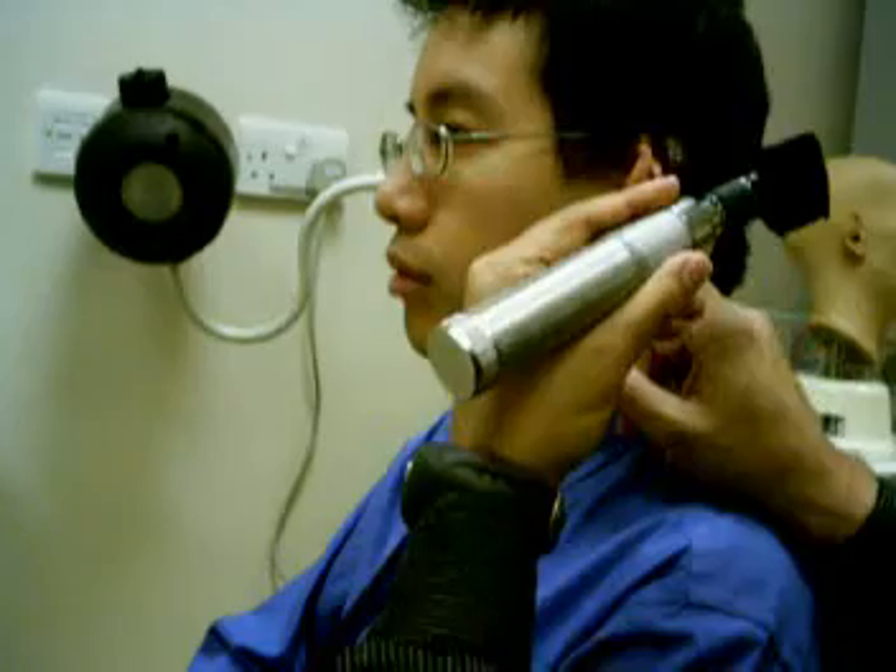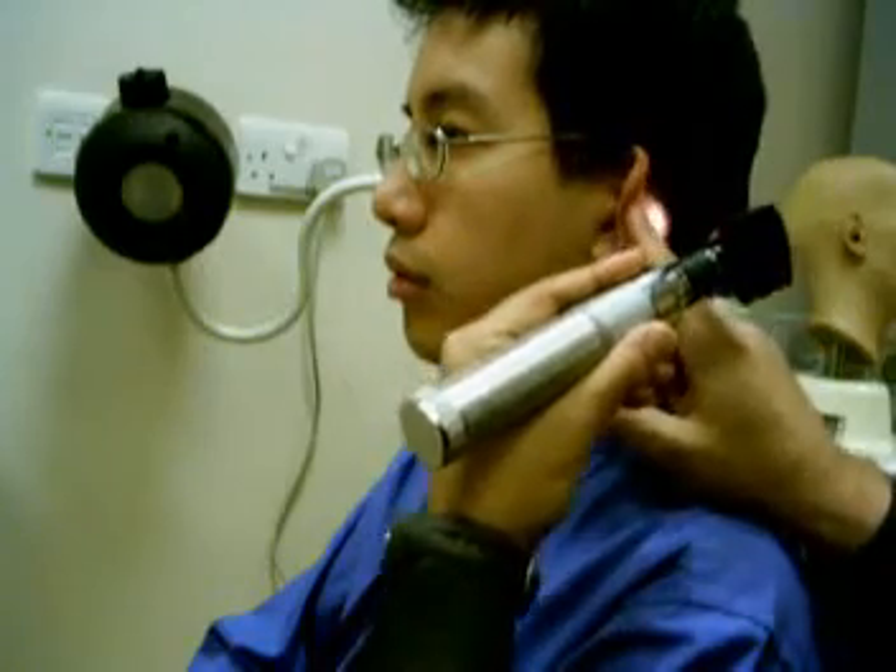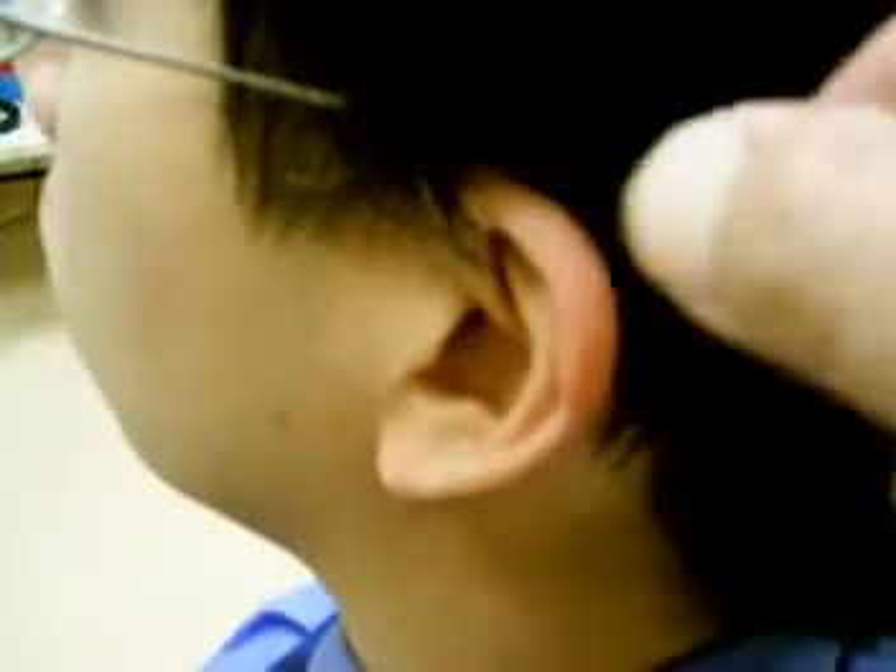Use the otoscope light to examine in front and behind the ear, checking the skin for sinuses and surgical scars.